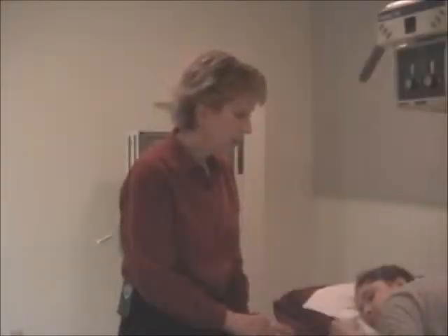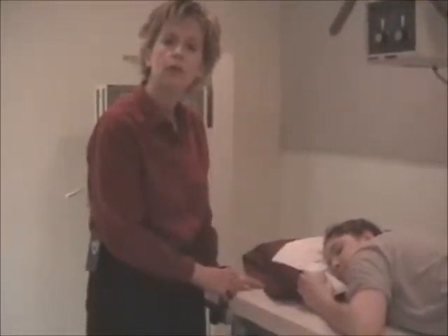I've got our patient Kristen set up for an RAO of the esophagus. Again, I'm going to start from the mouth and work my way down through the system. And remember, you may be taking this in different orders. The doctor's protocol will actually dictate what precise positions or projections you will be doing. But let's take a look at our patient here.